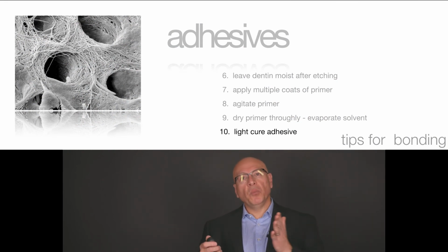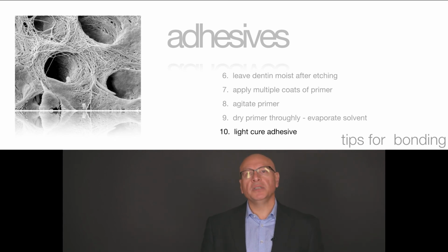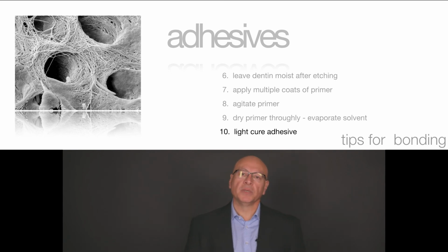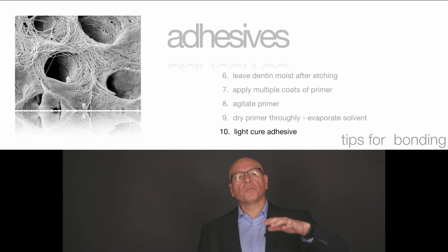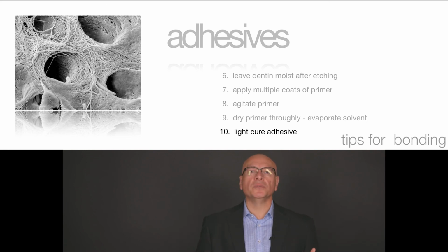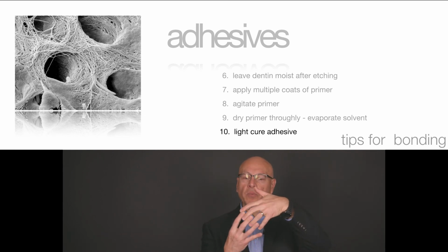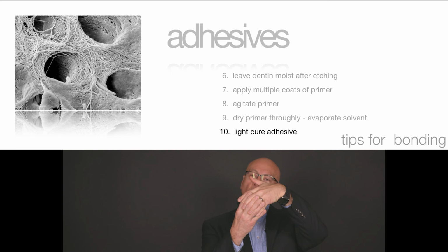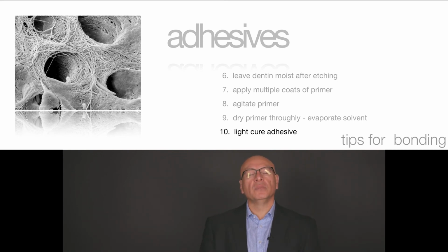What else do you want to do? After you apply your adhesive, the last step is to light cure. So every time you apply an adhesive, you always want to light cure that adhesive. It's very important. I know people will say, well, I want to save 20, 30 seconds of the light curing step, since when I put my resin, that resin is going to light cure my adhesive. But it's not really true. What you really want is to have that adhesive already set, completely infiltrated and penetrated into dentin or enamel, and light cured so it forms a good bond. So when the composite resin shrinks, it doesn't pull your adhesive from your substrate.